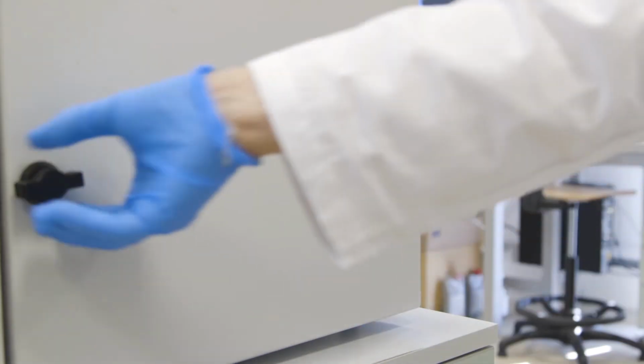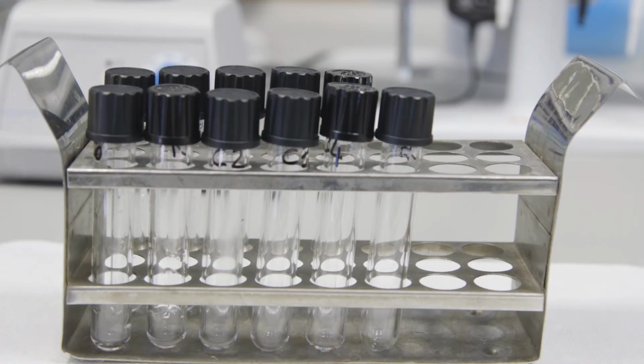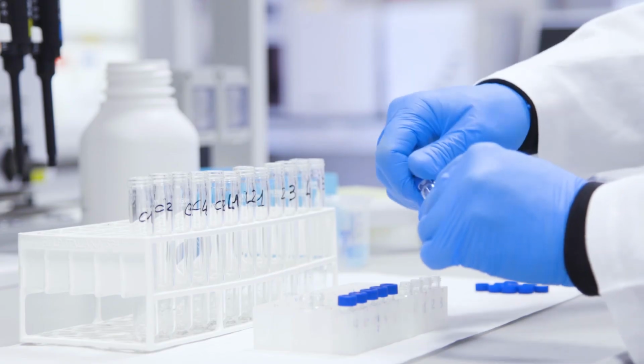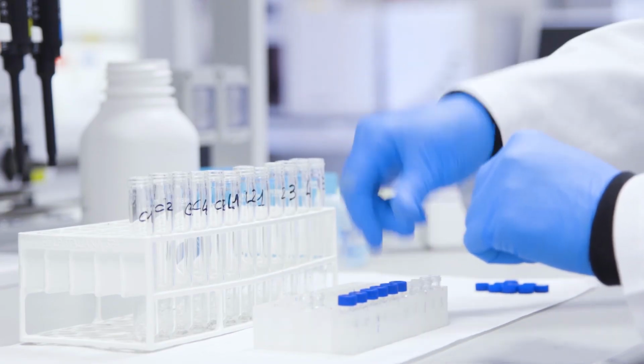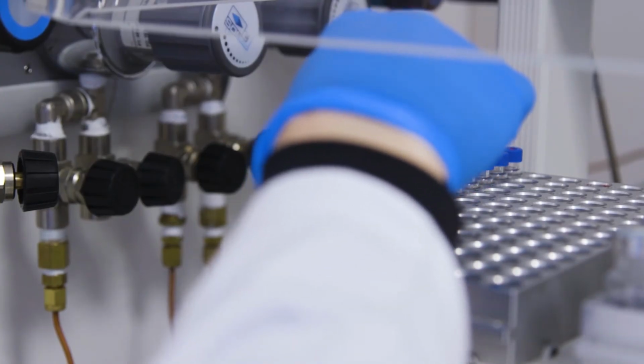When 20 minutes have passed, cool the tubes to room temperature. Then we transfer all the samples into vials with reduced volume for the autosampler. We place the vials in the tray of the autosampler and start the acquisition sequence.